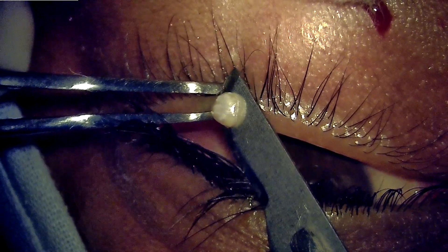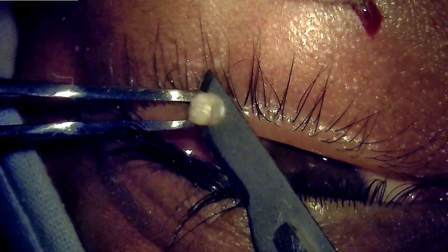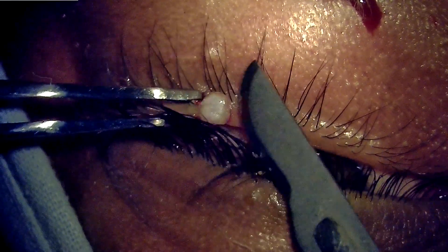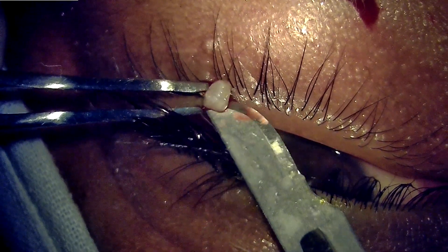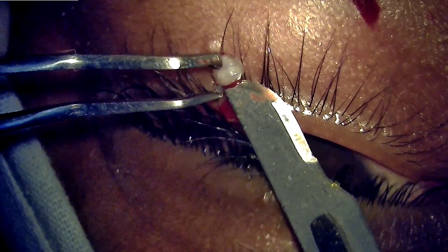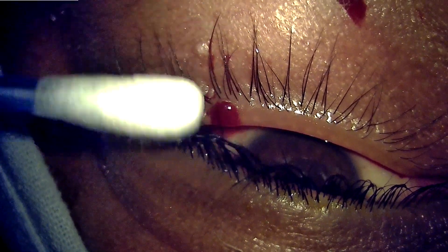This has to be a very gradual, slow process because the integrity and health of the lid margin is very important in maintaining the health of the eye, as it interfaces with the tear film — the first covering surface of the eye. Once the lesion has been excised, there is minimal bleeding, and one can simply press the area for a while, then patch the patient and review them the next day.